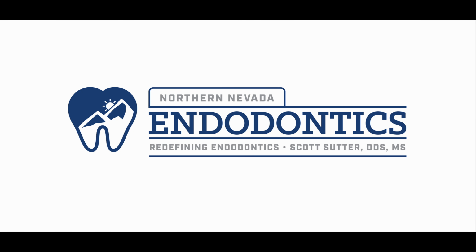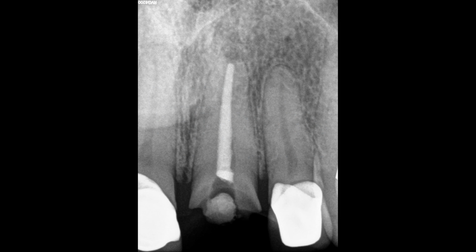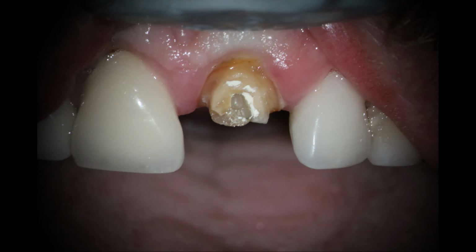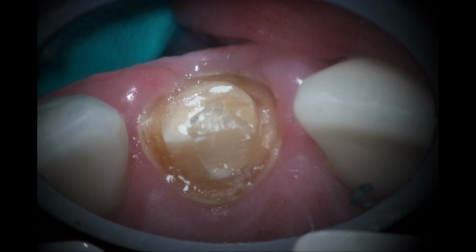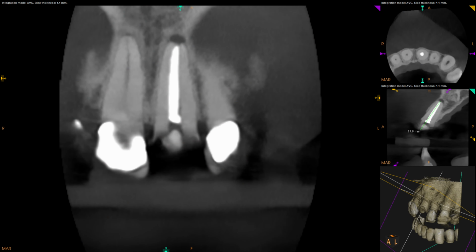Something a little bit different today. I just want to show what we can do to make patients' lives and referring dentists' lives a lot better. As you can see, the patient walked in with the crown in his hand, and not a ton of tooth structure left either. Most of the buildup had broken off inside the crown itself, so there was no salvaging this as far as putting it back on. As far as whether or not to do the root canal, there was a slight finding there. He needs a post. It's very quick for me to get there and clean it out.